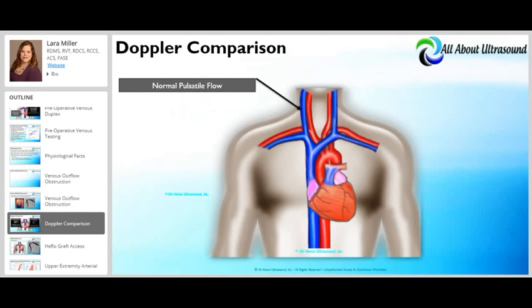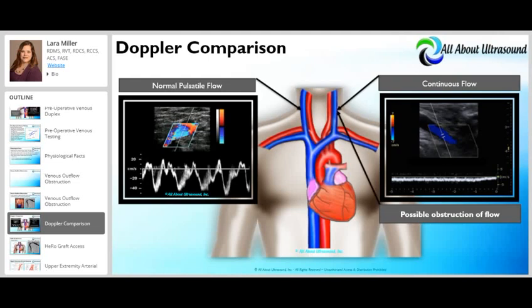It is important to know whether or not there is an outflow obstruction. Normal pulsatile flow should be found in the central veins due to their proximity to the heart and the cardiac cycle. If you have normal flow on one side and monophasic or continuous flow on the other, that should indicate that something else is going on and there is possibly an obstruction of flow proximal to that location.